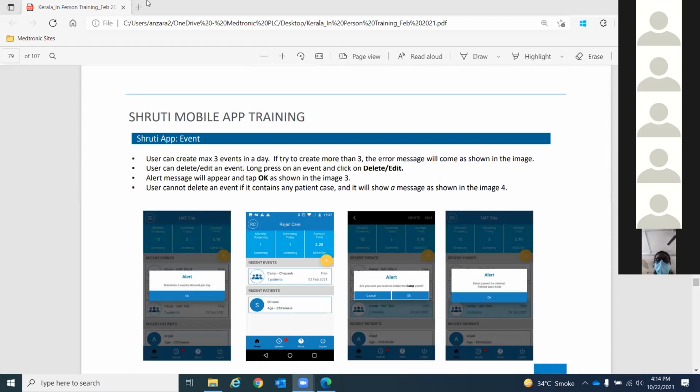No, there is no problem if it appears occasionally while using the app. If it comes, you can set the alignment. It won't come occasionally. When you log out, then only it will ask you to do the alignment, or if you are using the device for the first time. Otherwise, it won't appear. And if it is appearing, you just need to set the alignment, and then you can use it. It doesn't mean it is a problem. If it is appearing again and again when you are using it, then you can escalate it. Okay, otherwise it's not a problem.